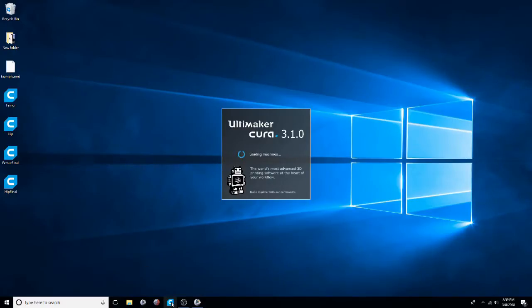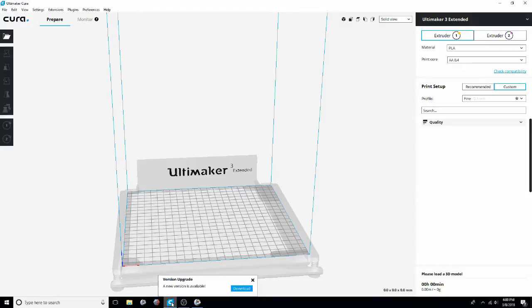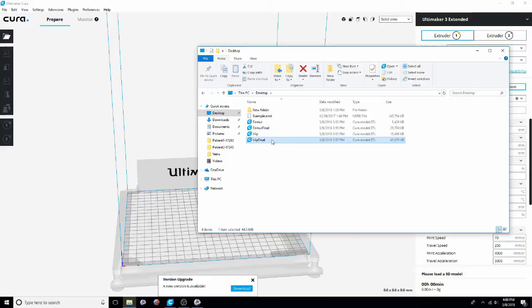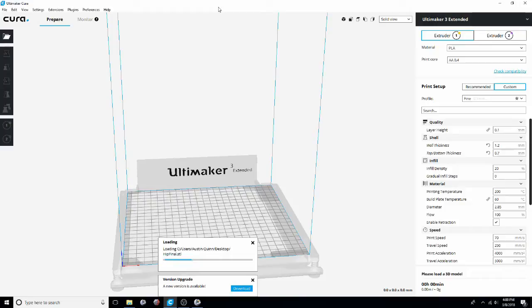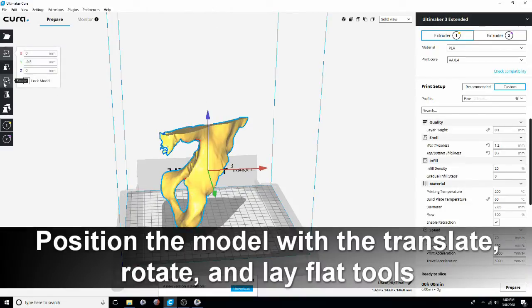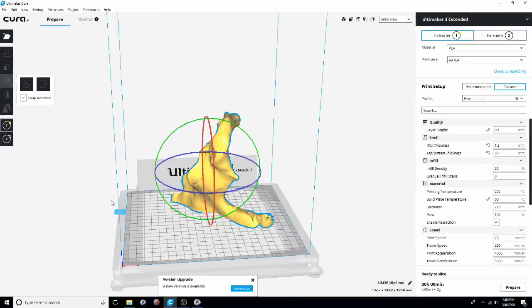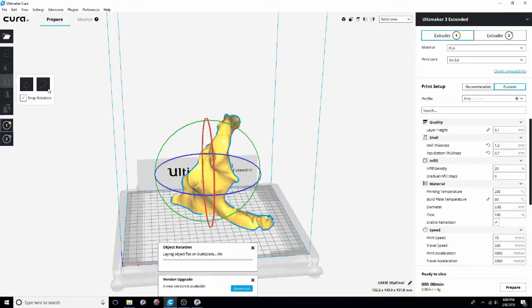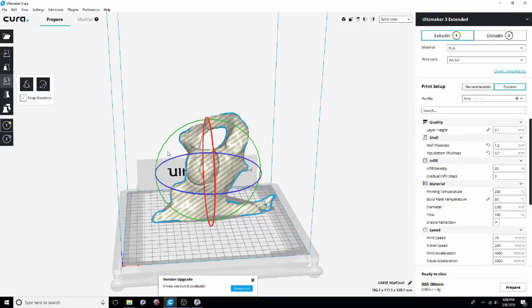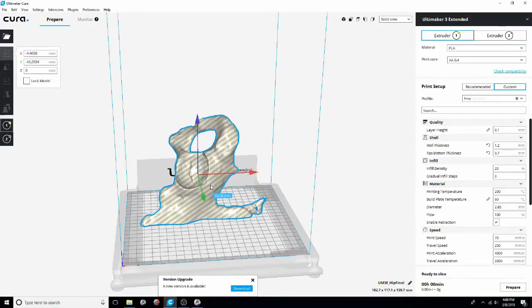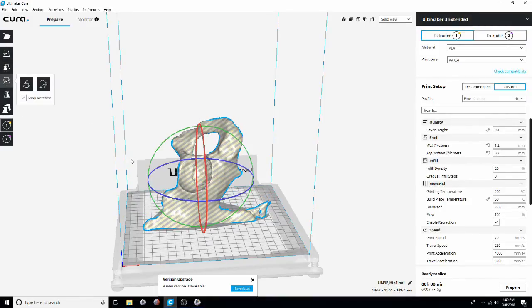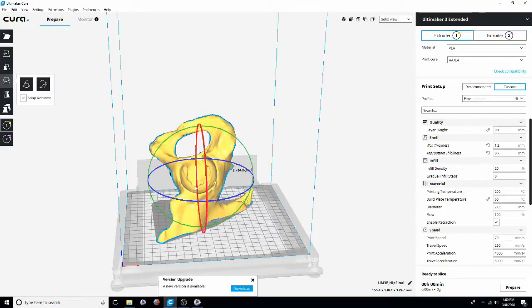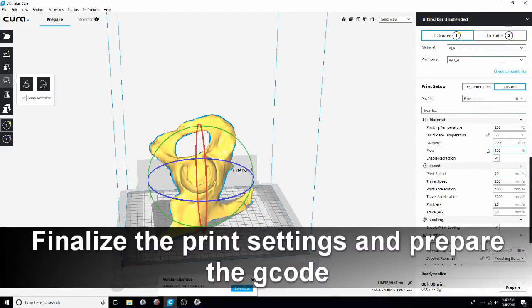But for this tutorial I didn't want to take up the space on my computer. For the final step you'll open up Cura or your slicer, not 3D slicer but your 3D printer slicer program of choice. You'll want to make sure that the model's on the build plate kind of wherever you want it. So using those translate and rotate tools, the lay flat tool's really nice. And then just make sure that it fits in that build space. Once you have the model positioned correctly you can run through and make sure that all of your print settings are to your liking. Prepare that g-code file and then you can get it printing.